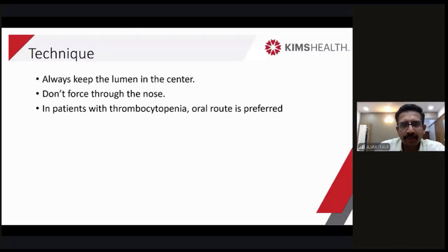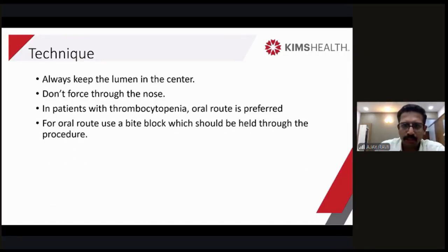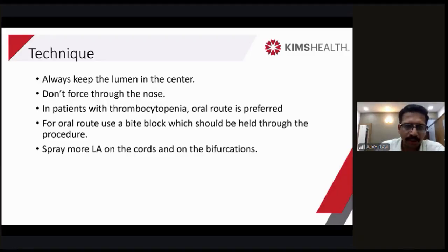Now the tips. As you go in, always keep the lumen in the center. The darkness of the lumen going distally should always be at the center of your screen. If you're going through the nose, don't force it in; find a way and navigate very carefully. If the patient has thrombocytopenia, the oral route is preferred, not the nasal route. Whenever you use the oral route, you use a bite block, and you should have an assistant hold the bite block throughout the procedure.